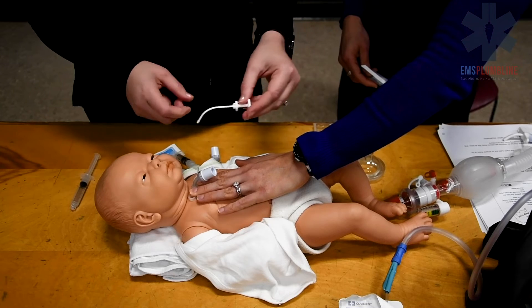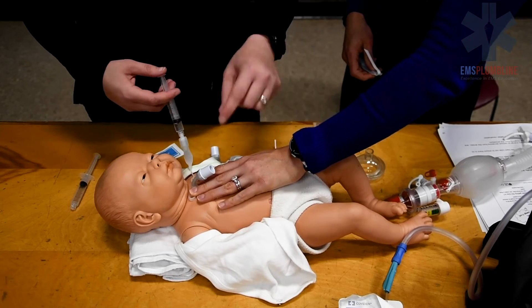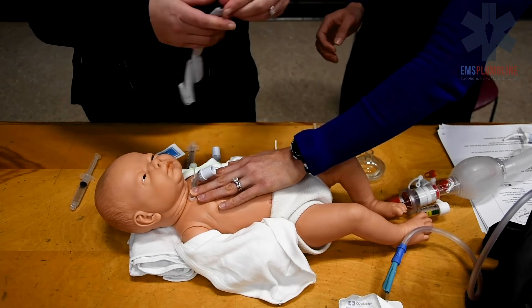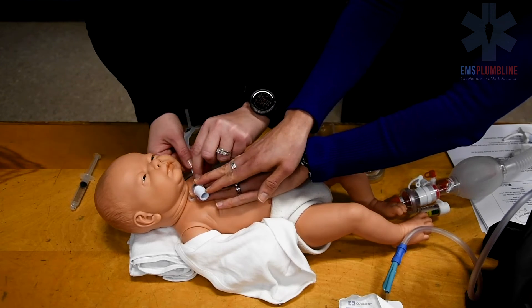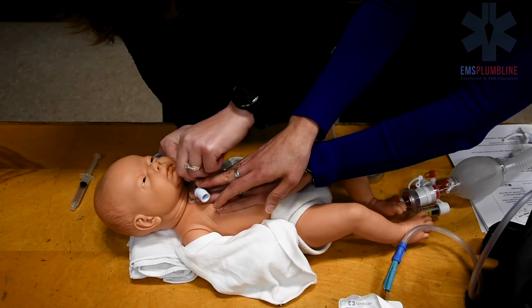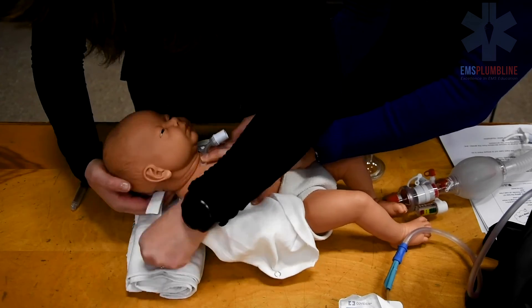Continue holding the trach tube in place and inflate the cuff if needed. Attach the new trach ties and ensure that the trach ties are tight. While still holding the trach tube in place, sit the child up and lay them down.